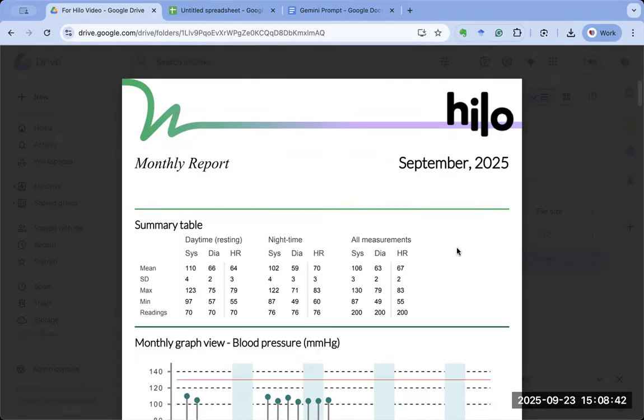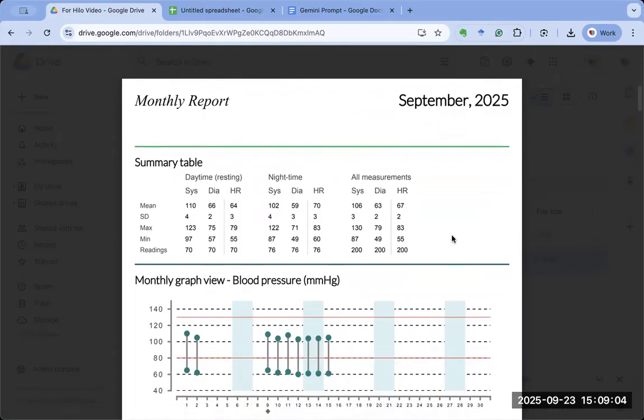We used that upper arm cuff device, which wasn't always accurate because of the ways it is measured. If the arm is not supported, the back is not supported, the legs are dangling, not supported, or we have had caffeine recently, or have a full bladder, all those things can contribute to inaccuracy. Compared to that, what the Hilo device does, and what I absolutely loved it for, is it measures blood pressure in the background without me having to take manual action.